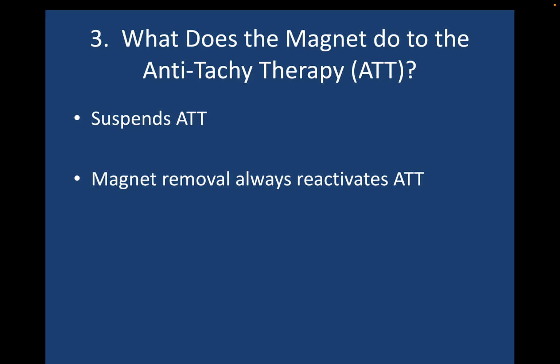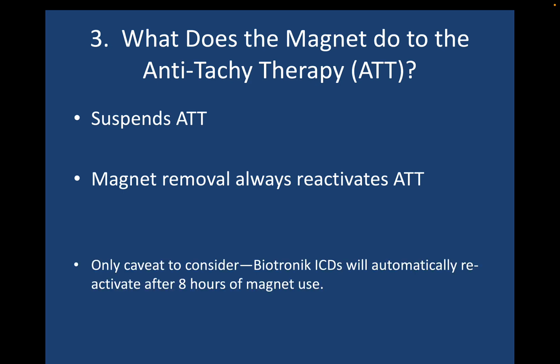There's only one caveat to remember: if you are using a magnet to suspend the anti-tachytherapy of a Biotronik ICD, the ICD will automatically reactivate after 8 hours of magnet use. If you want to continue to use a magnet in a procedure that's going past 8 hours, you need to remove the magnet about 3 feet away for about 30 seconds, and then you can put it back on and get another 8 hours of inhibition.